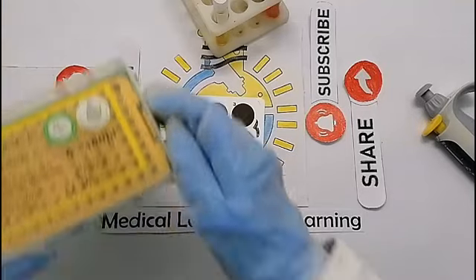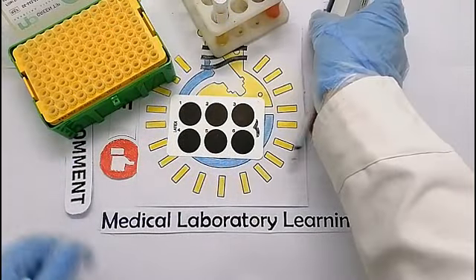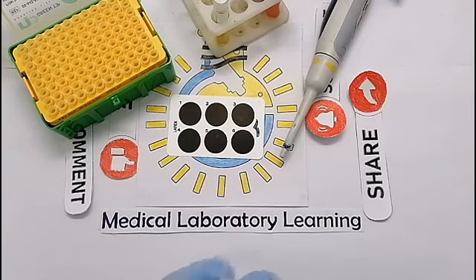After we make sure that this kit is working properly, we proceed to perform the test for the patient.